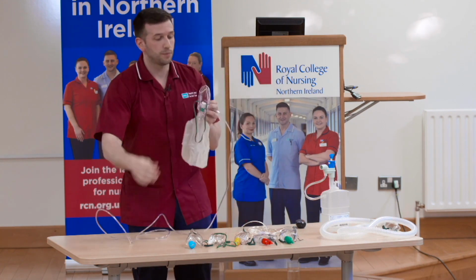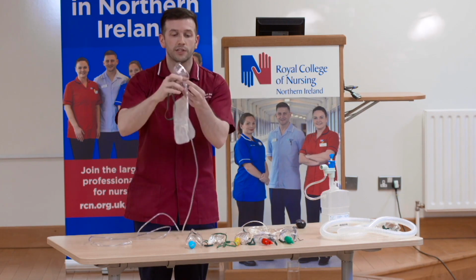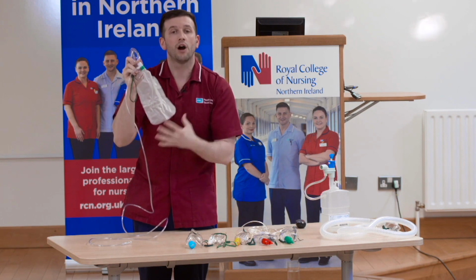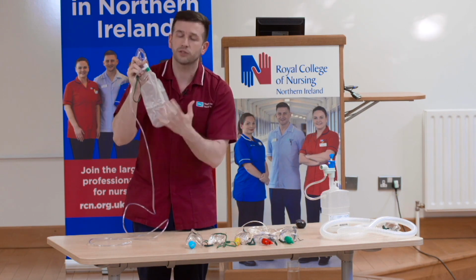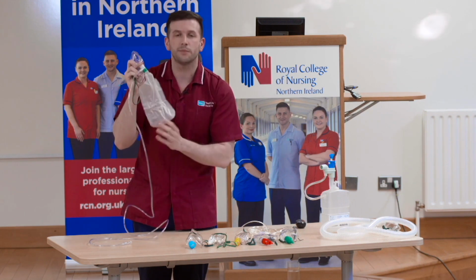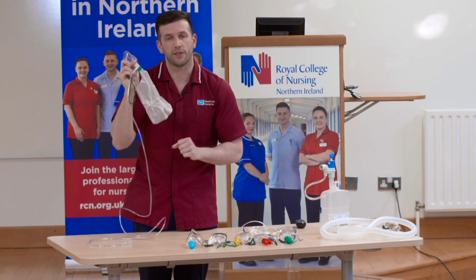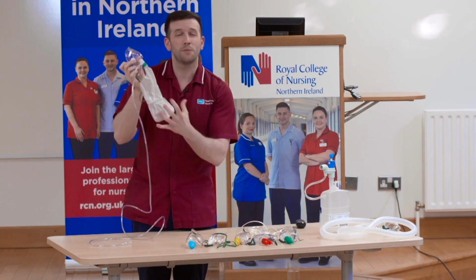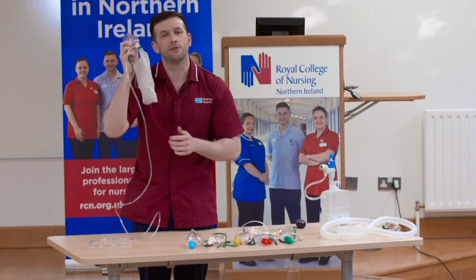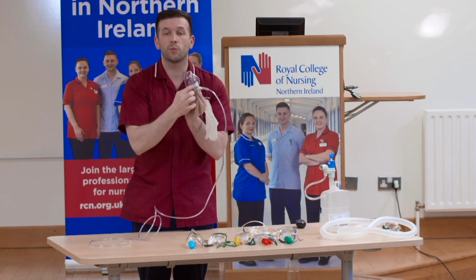The first thing that you must do is occlude this one-way valve, and when you occlude this one-way valve, you will see the reservoir bag fill full of oxygen. You must ensure that the bag fills more than 2/3 full, and we estimate this is roughly a litre in total that it can hold of oxygen. The next step is that you must squeeze the bag just to check there's no problems with the valve, and then re-inflate it again.